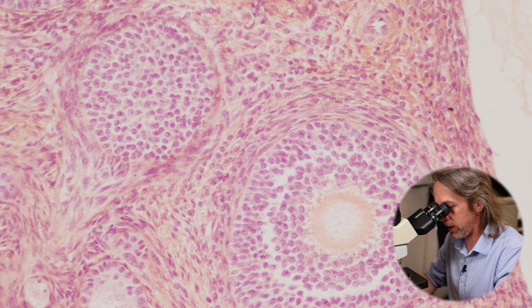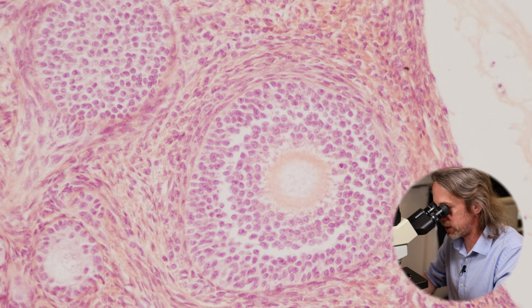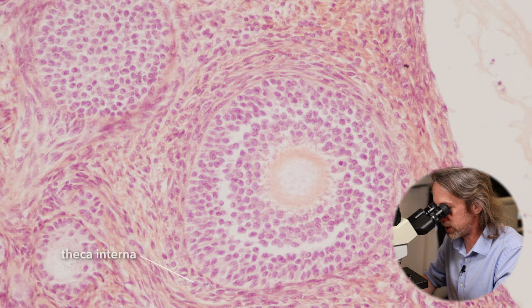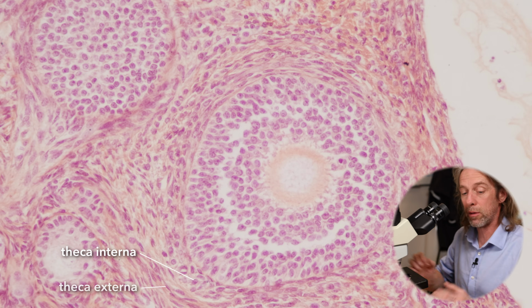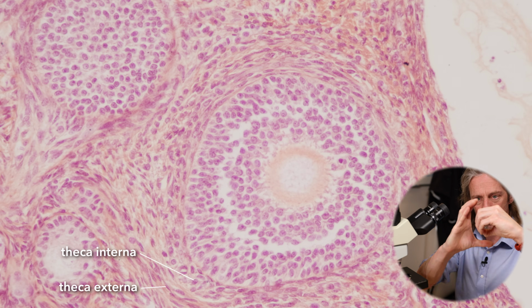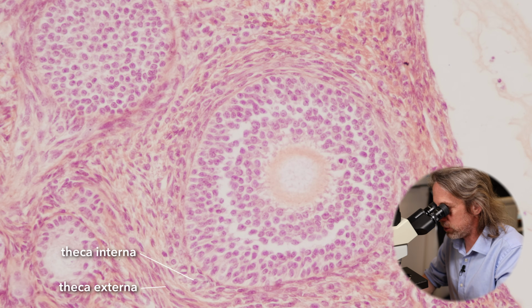And look, if we look over here, we're seeing even more development. We're seeing multiple layers of granulosa cells. We're seeing the follicle in the middle, and we're seeing maybe there, so the thecal cells will form 2 layers, a theca interna, so an internal covering, and a theca externa, an outer covering. And they're going to do slightly different things.